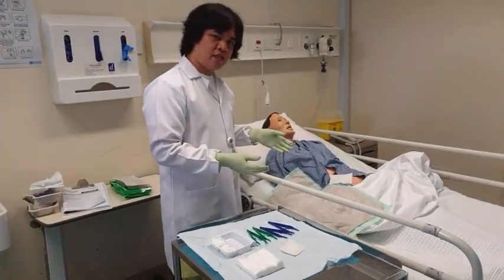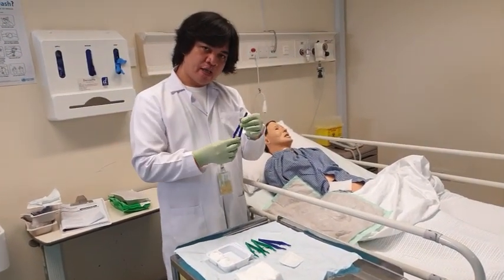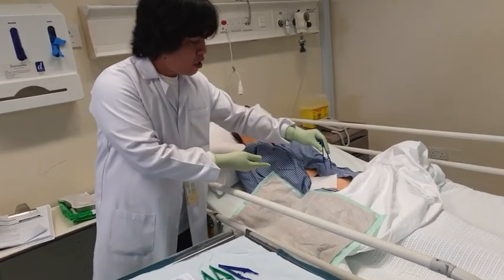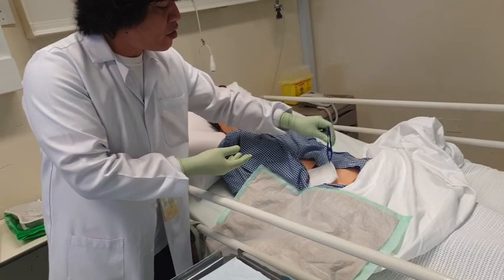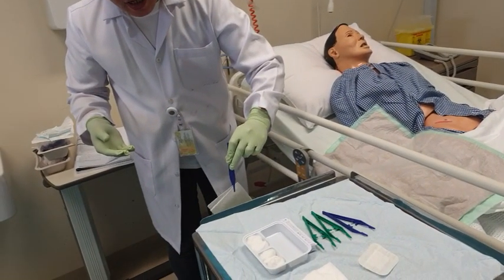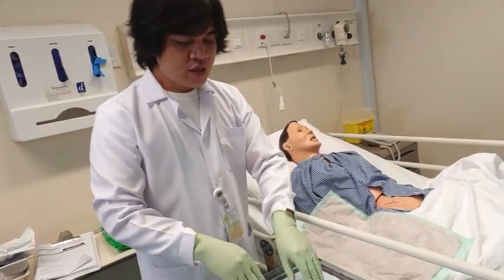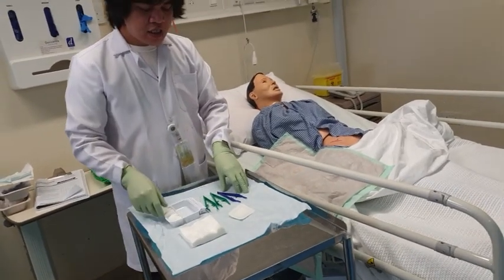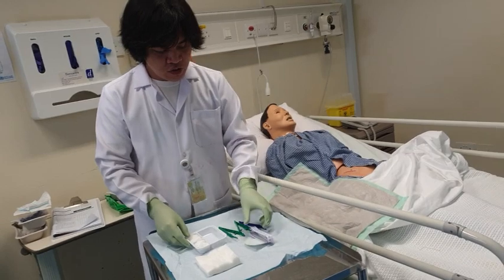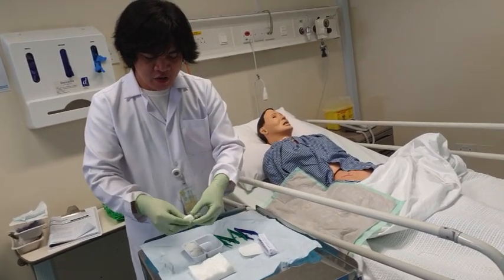Now, how do we start the procedure? With the use of your forceps, like this one, try to pick the gauze that we have covered the wound with earlier, and drop it into the yellow plastic together with the forceps. So at this point, I can now start cleaning the wound. So how do I do that? Of course, you need also to squeeze off excess normal saline or cleaning agent here.